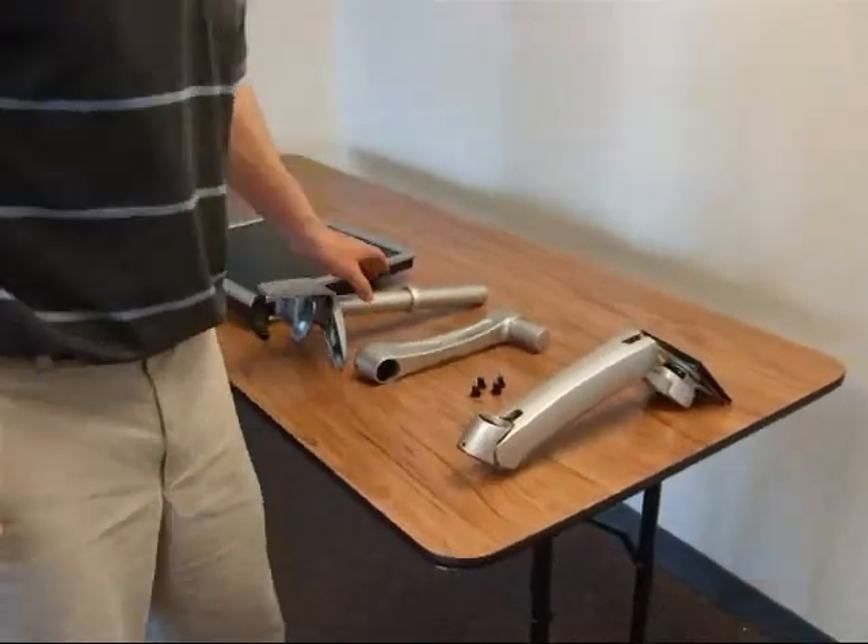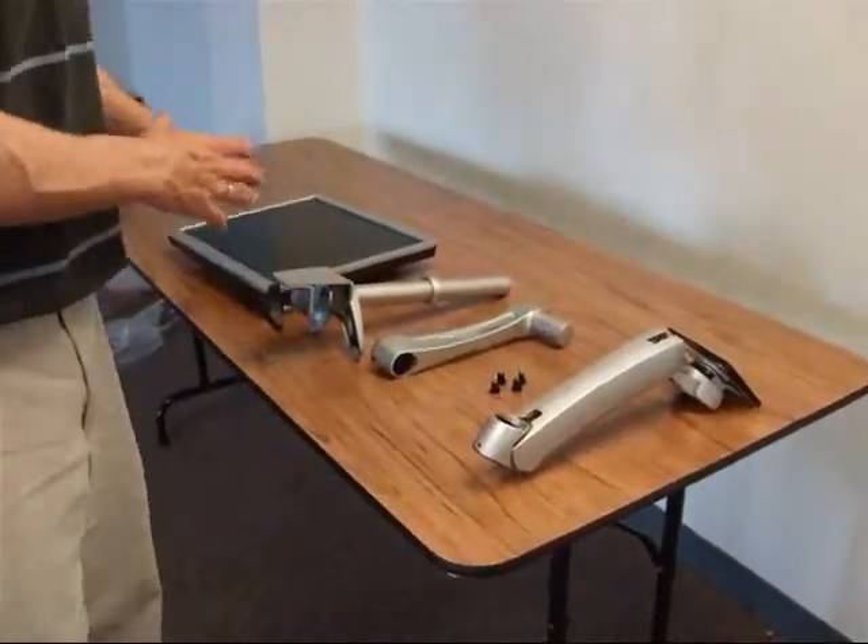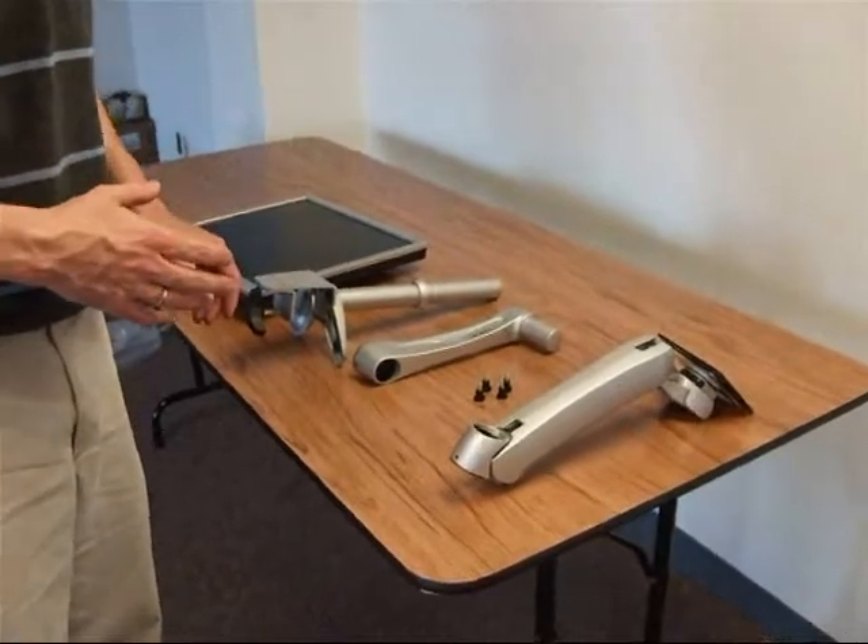In this little movie I'm going to show you how to set up the monitor arm and the monitor for an Optron.